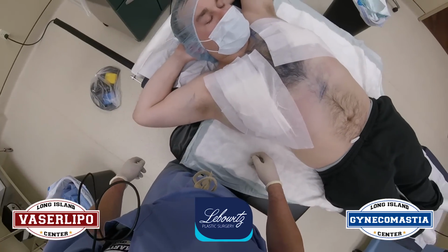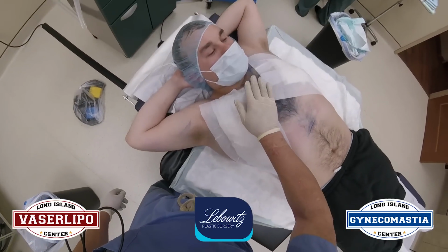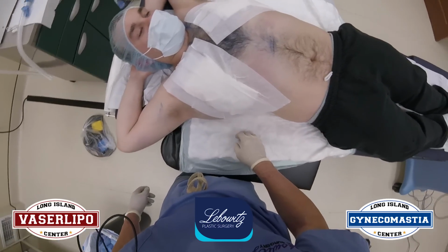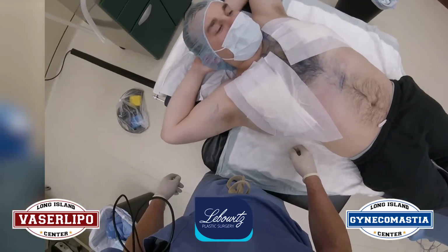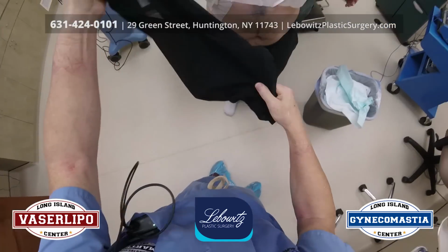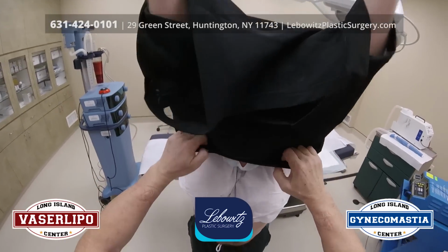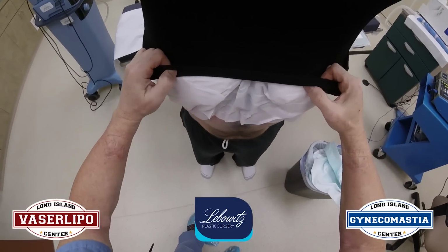I'm going to see him in 48 hours to do the first dressing change. That little rubber band drain will come out at that time. The drain will drain into the dressing, so he doesn't know anything is even there, and he doesn't have to be bothered with it. So now we're going to get the garment on him. And this is the compression garment. He's got to wear it for 6 weeks. Get it over your head. Ready, on your mark, get set, go.